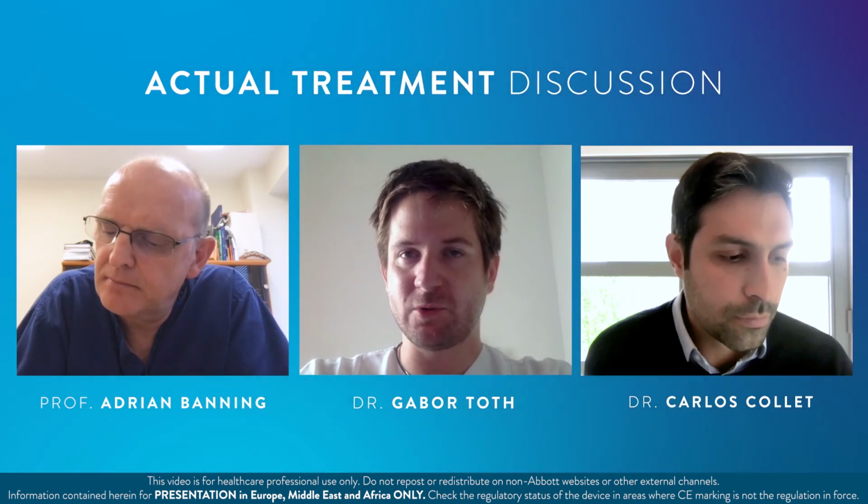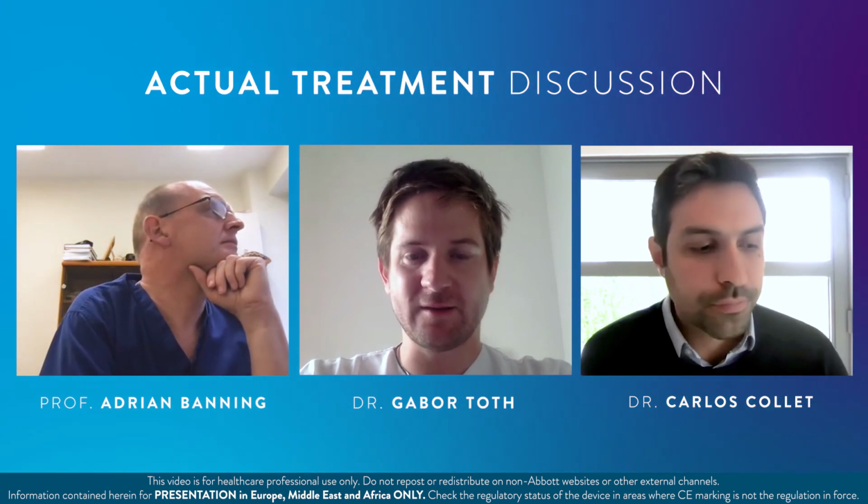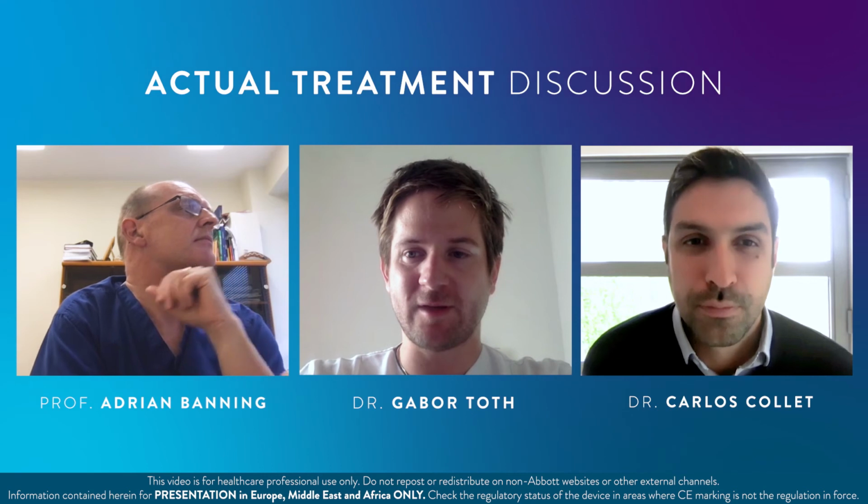So, Gabor, you have a question for Carlos? Yeah, actually, it's not even a question. It's more a comment: I believe that with imaging, you understood very well the extent of the proximal dissection, and to what extent you need to stent proximally to cover it.